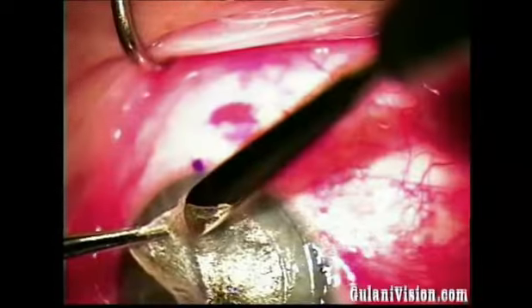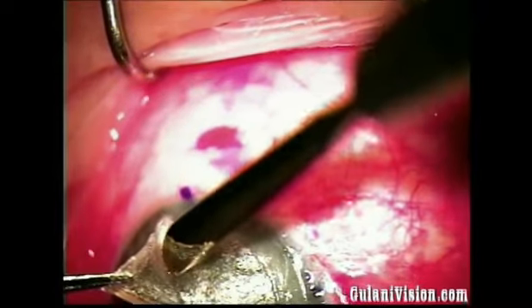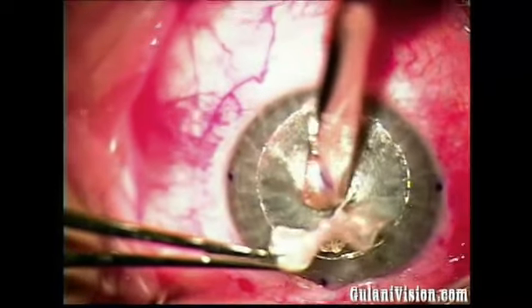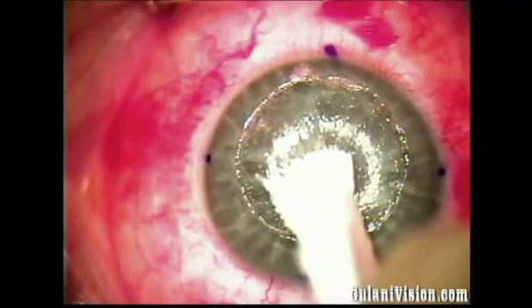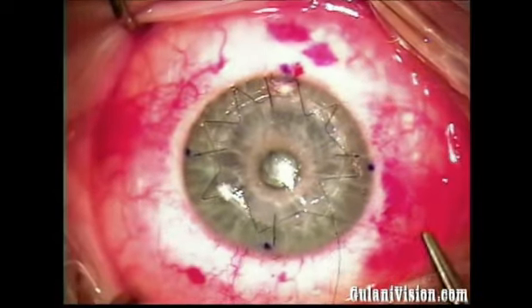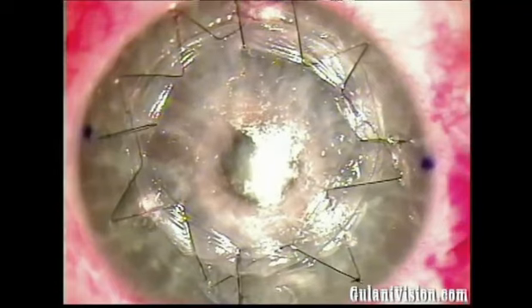I'm now proceeding with a blunt multi-directional modified tooth blade of my own design to help me dissect this cornea, coming in from the periphery and lastly to the center scar area where you can see these adhesions that I'm carefully separating by using resistance to prevent tearing through the stroma close to Descemet's, as you can see here in this ectatic area. I'm now creating the peripheral pocket for a good fit for the donor cornea. Anti-torque 8-bite running suture following 4 stabilizing sutures to a complete lamellar endpoint.